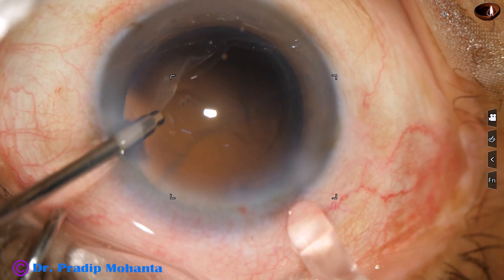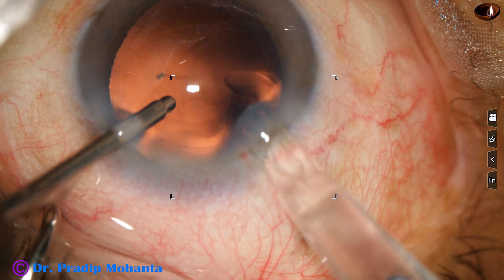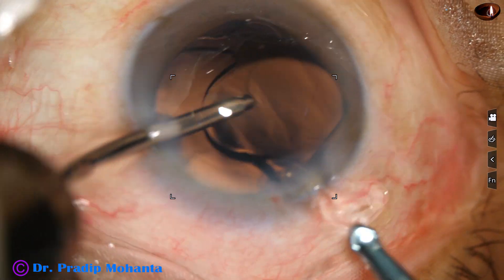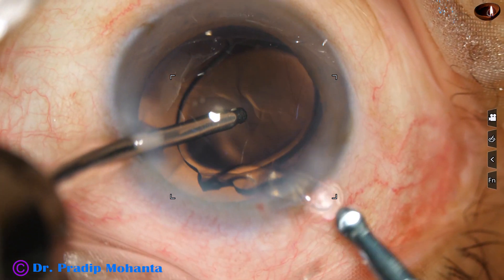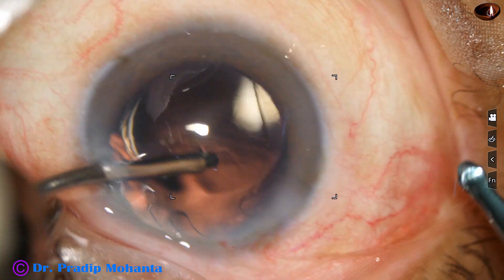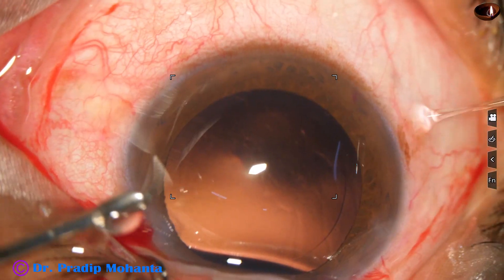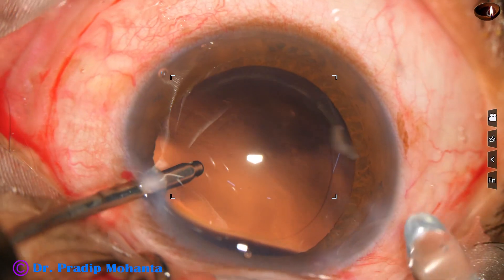This is also a hydrophilic acrylic lens. As it goes, it opens abruptly and sometimes the lens pushes the posterior capsule towards the vitreous cavity. This is another one.